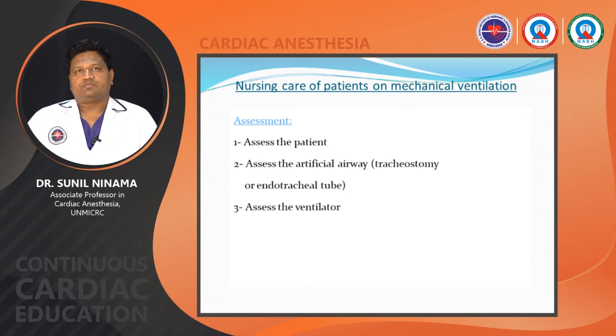Nursing assessment is very important. The nurse must always look at the patient. She has to assess the patient, assess the artificial airway like a tracheostomy or endotracheal tube, and she has to assess the ventilator.